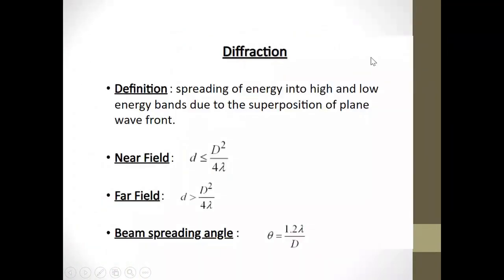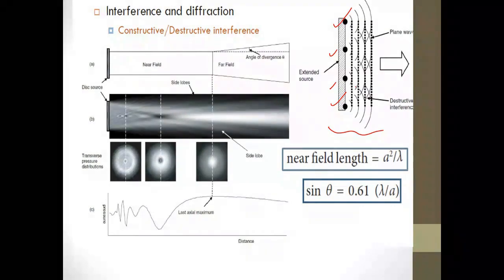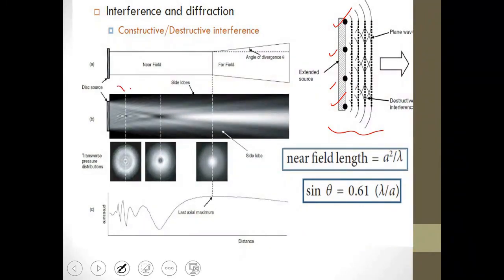Look here, you are in this area. The interference that occurs between this point and that point and that point begins to create a specific area in a certain region that I call the front. This front is the area where there is the highest constructive interference and the highest homogeneity concerning your pulses. This area is known as the focal zone. The focal zone is the area that comes after the near field. I refer to the first area as the near field and the area that comes after the focal zone as the far field.